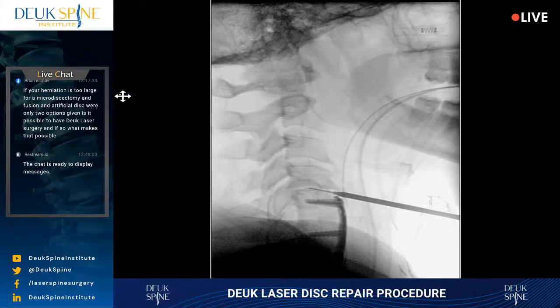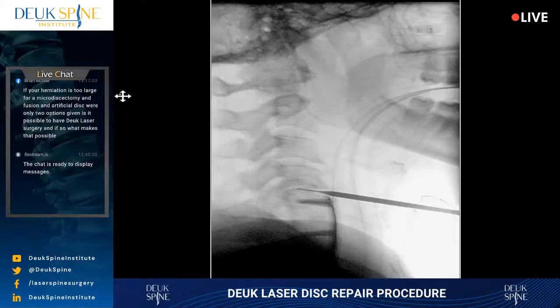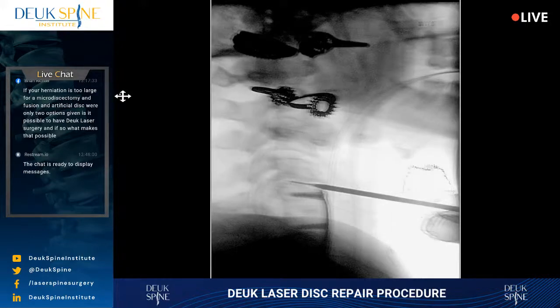Can you give me some inline traction, please? Let me know when you're ready. So slight extension with traction. That's pretty good.